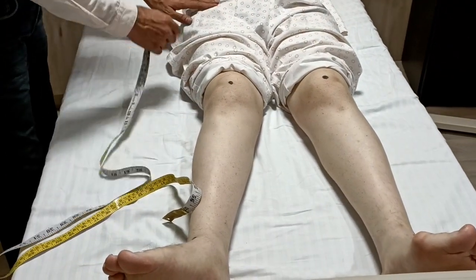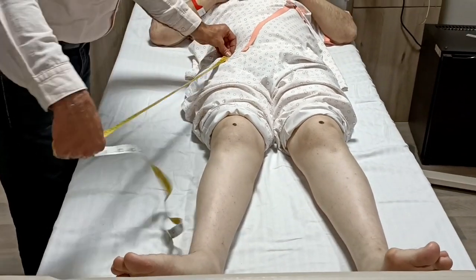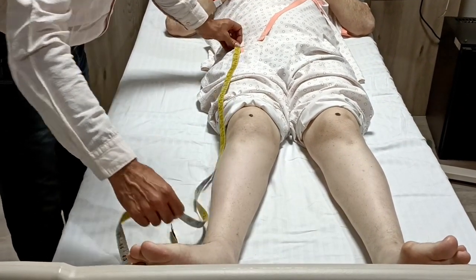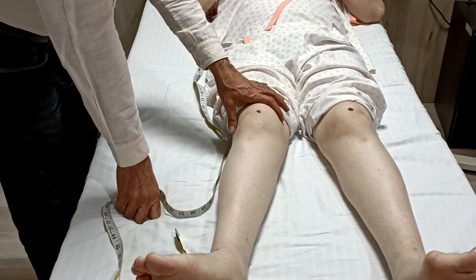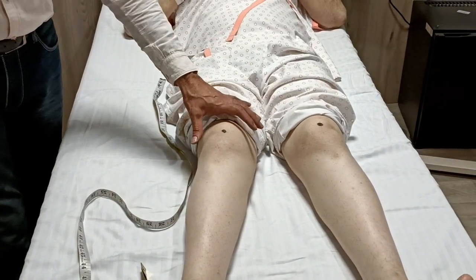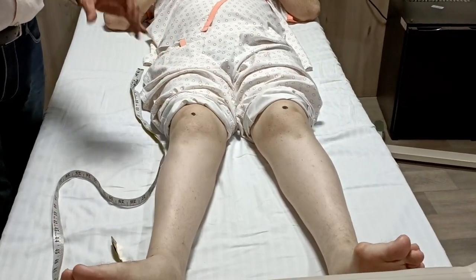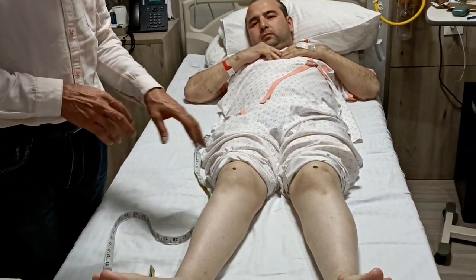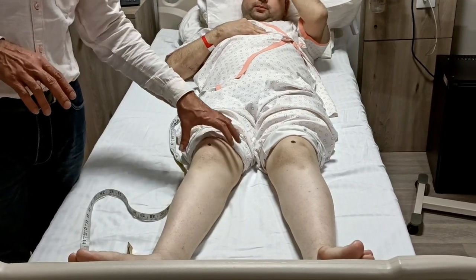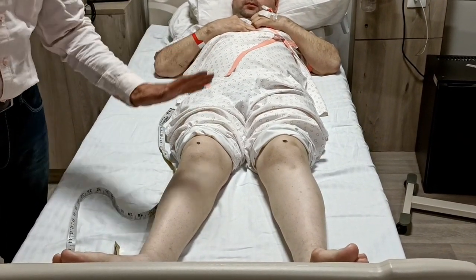If we do it on this side, this is the hip joint and this is the ankle joint — it is still more outside, that means the valgus deformity is more on this side. So when we operate, when we are planning the knee replacement because both the knees are very painful, this valgus deformity has to be corrected. All these angles we have measured by taking his scanogram right from hip to ankle.